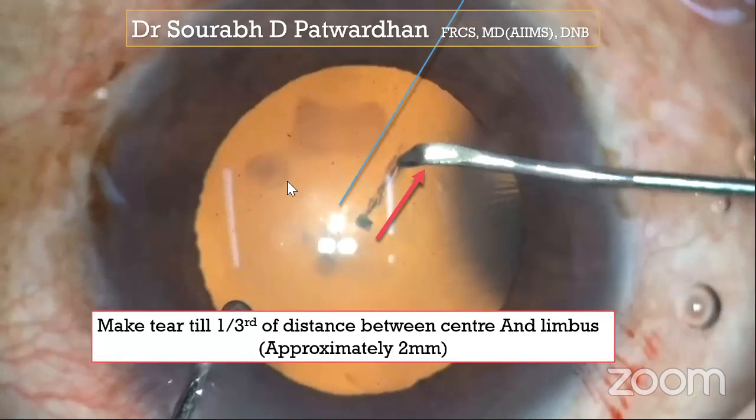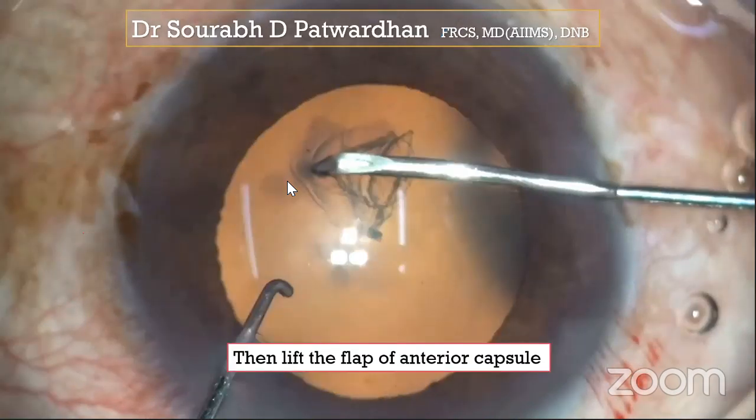Now, why is it important to make the tear exactly near the center? That is because the first moment where you create this radial tear and then lift the flap by going slightly under this tear and pushing it upwards is the most uncertain step of capsulorhexis. You will realize it. If you start this at the periphery, at the moment you lift up this capsulorhexis edge, you may have it extending towards the zonules because it is a highly uncontrolled step. Whenever you manipulate the flap, it is more controlled. But if you try to lift the flap, it is not well controlled.